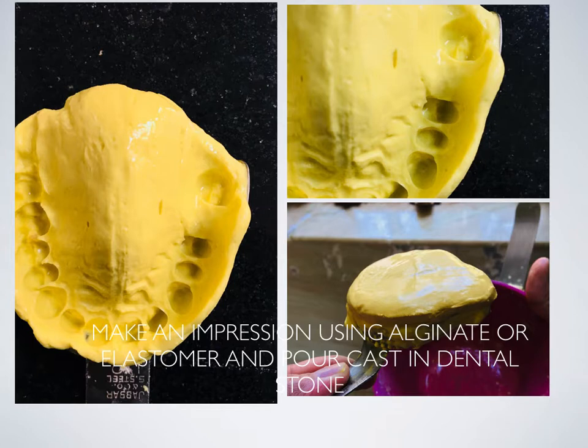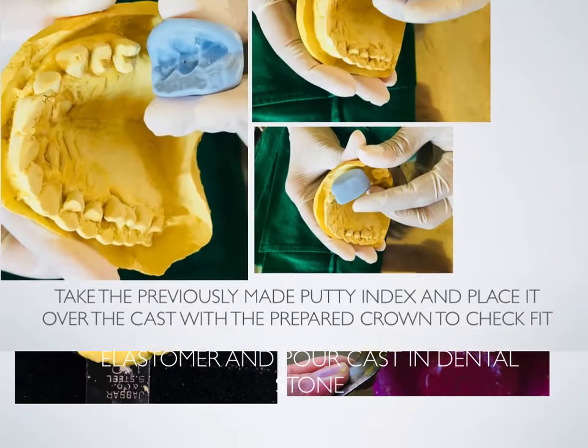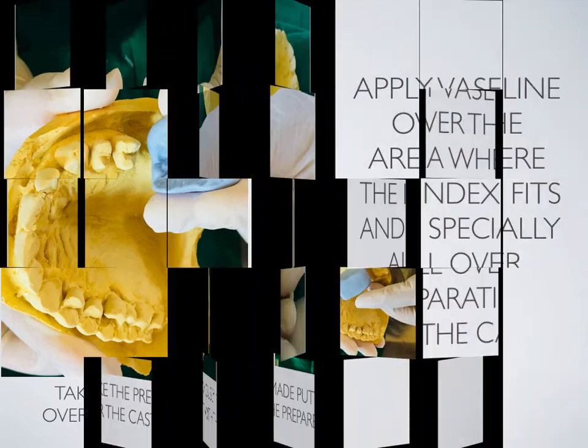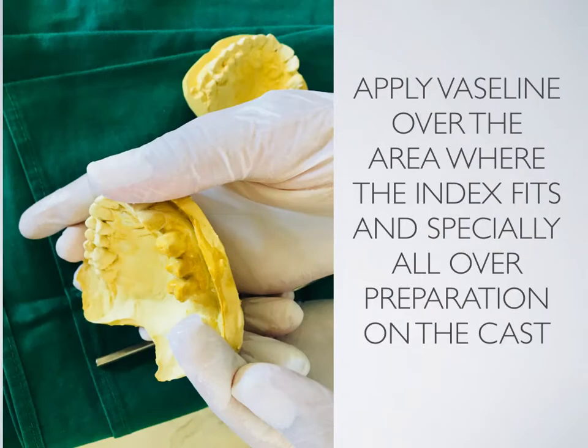Make an impression using alginate or elastomer and pour the cast in dental stone. Take the previously made putty index and place it over the cast of the prepared crown to check its fit. Apply Vaseline over the area where the index fits, and especially all over the preparation on the cast.